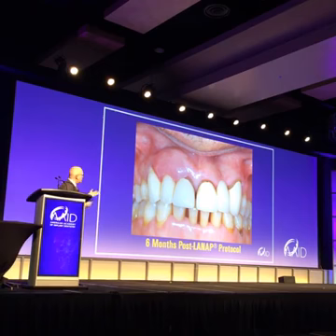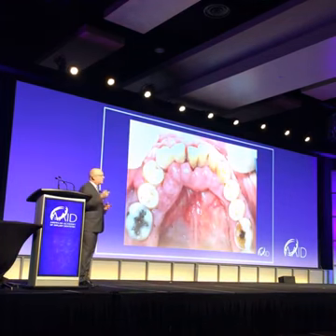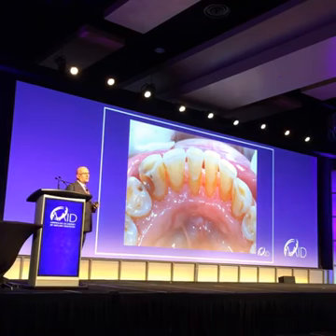But look how nice the tissue's kind of shrunk down. It's settled. We can go ahead and start some restorative work if we need to, but we can see where we need to maybe do some touch-up work. Here's his lower, same thing. Where would you start? I didn't want to take any teeth out on him because I couldn't give him a partial, because I don't know where the tissue's going to end up. But 6 months later, this is the way it looks.